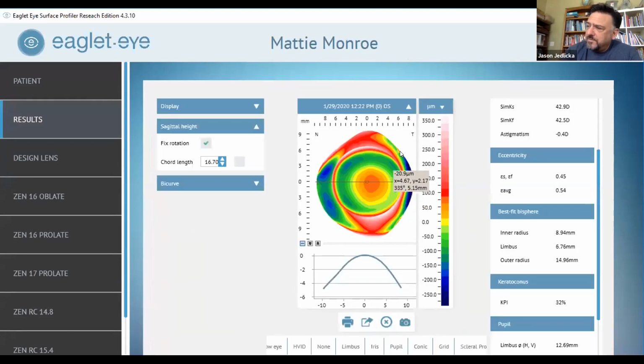So this is a patient very different, as you can see by her cornea. She's quite spherical. I think she has less than a diopter of astigmatism corneally, but she's very against the rule in her sclera. In this case, the vast majority of the difference in elevation between the two meridians is in the scleral zone, not in the corneal limbal chamber of the eye. So this patient would be better served with just a standard spherical base curve, spherical lens with all of the toricity being built into the haptic, because that's where it occurs.